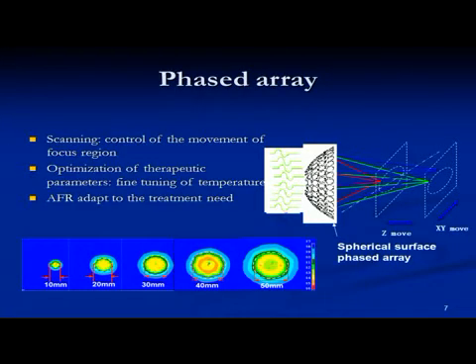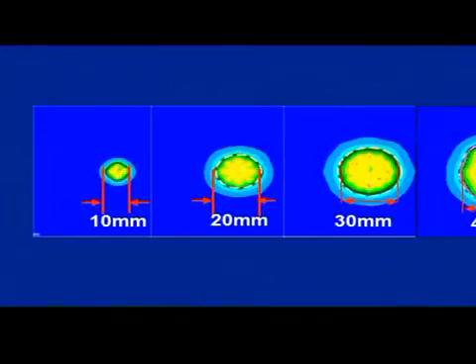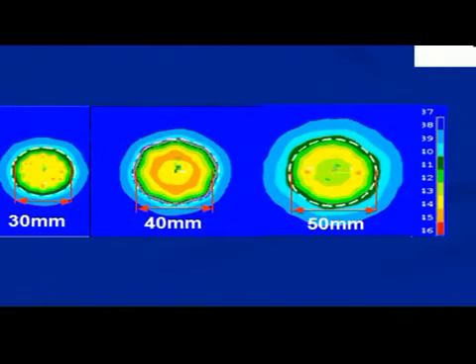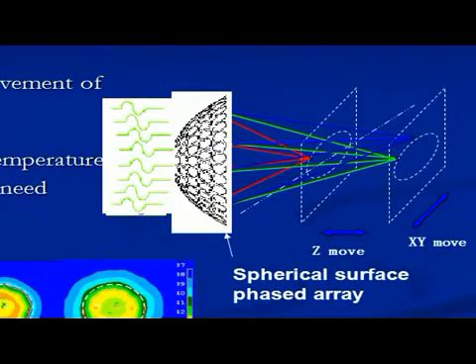How can we comprehend that the treating area is a component of many points? It is just like a digital picture, which is a component of elements. And how does the focus move? It can move mechanically. The phased array equipment is more advanced. The regulation of phase difference can move the focus and adjust the size of the focus. However, the circuit system is complex.